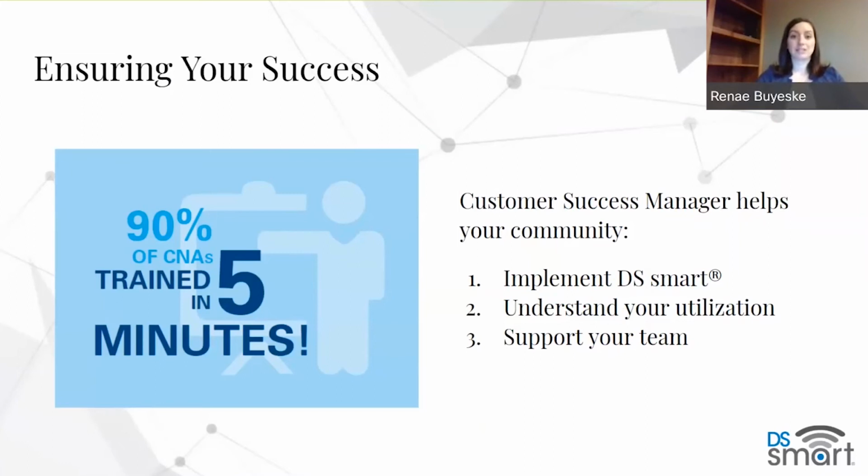Implementation can be as easy as helping you track your equipment and letting you know when it'll arrive, to being successful with putting everything together and any questions that arise in that, and helping you get the connection and the communication for your EMR open and going. So requesting that access and making sure everything flows and is good to go for that part. So implementing, getting your equipment there, and getting your staff up and running.